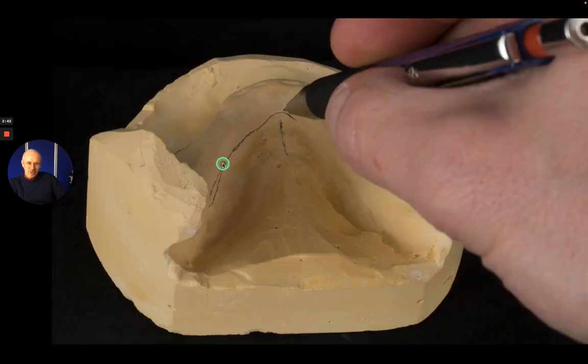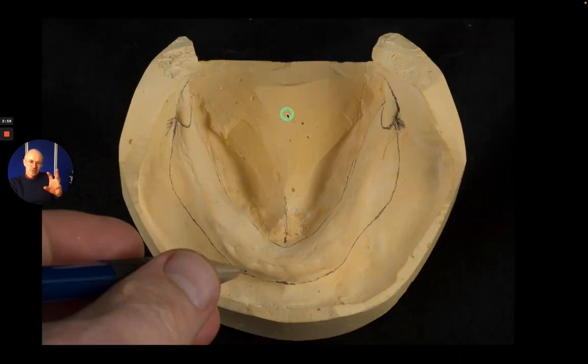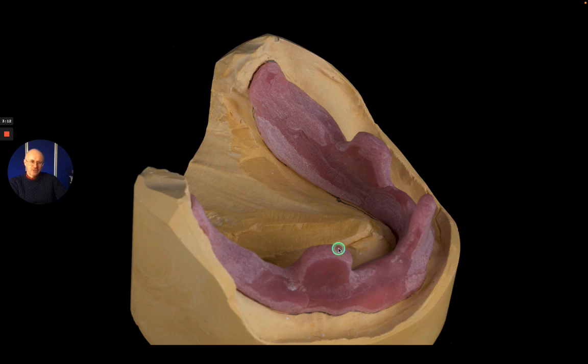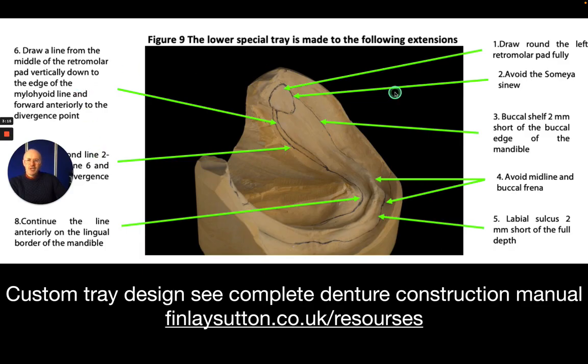And then finally I draw a line right on the lingual edge of the mandible, all the way around, avoiding the genioglossus insertion — the genial tubercle — keeping that just out of the way. So that's one side done; I repeat that on the other side, and then the custom tray is made to the outside line of this with three stub handles. This is all summarized nicely in my denture construction manual, which you can download from my website — it's a six-step process to design the special tray, and this is really crucial.